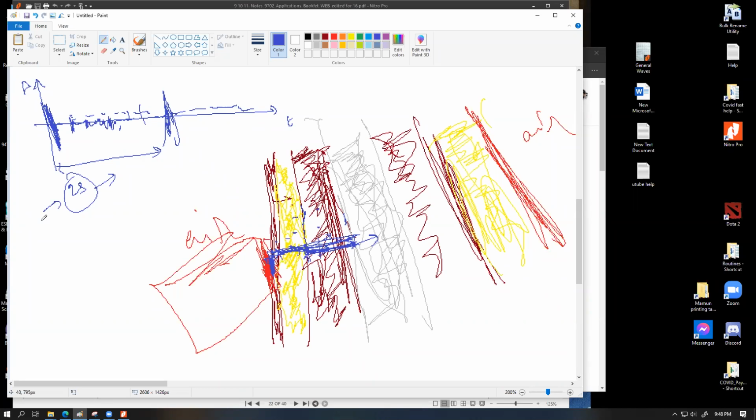For example, let's say we are trying to scan a thigh of a certain person where there might be a tumor. A regular person's foot or thigh scan should look like this. But a person who has developed a tumor might have unnaturally large reflections over here, which is the anomaly. That anomaly can tell us exactly where the tumor is, how big the tumor is, and all this other information. So the difference from the regular is what we are trying to diagnose.